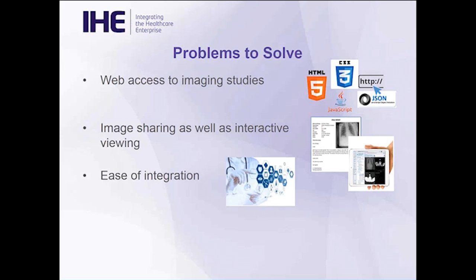And because it's using web access with a RESTful API, a side benefit is that it allows much easier integration with many different applications, EMRs, and different systems. That is a growing trend in application development: integration is a part of the core development.